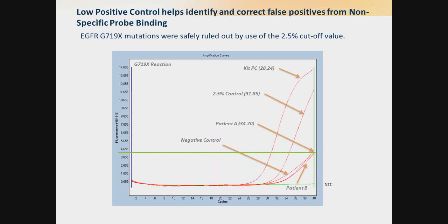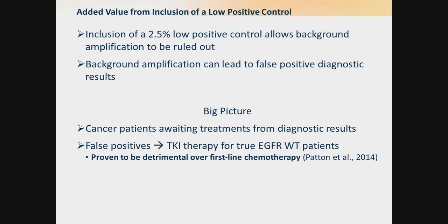Looking again at the results for G719S when we have included a low positive control, we see that the patient result is overlapping with the negative and we can safely rule this out as a negative. The value of including a low positive control allows us to rule out any background amplification and not report any false positive diagnostic results.